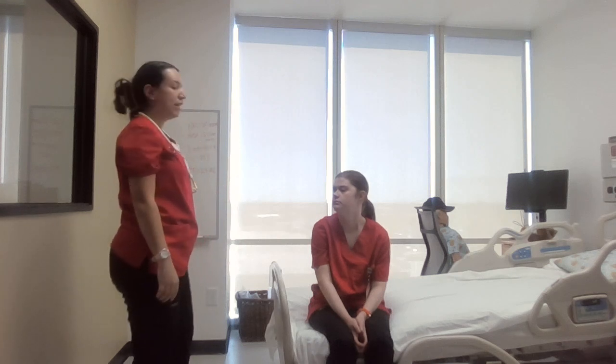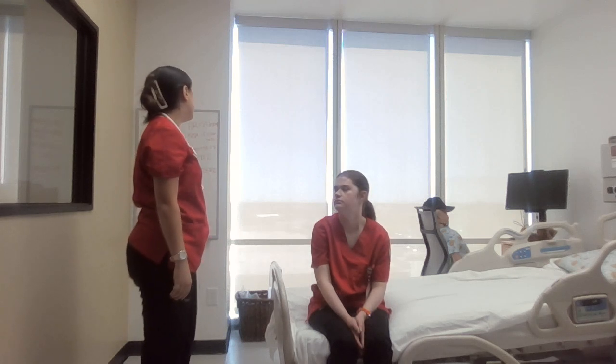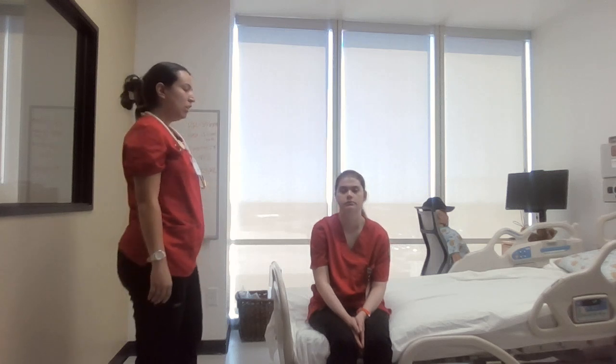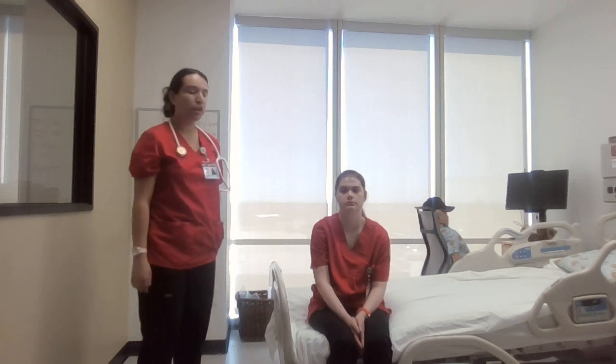For the heart rate, which was 80 beats per minute, +2 on the left radial pulse, regular rhythm, and then the blood pressure was 124/82 on the right arm. Next thing I'll do is ask them a few questions about their cardiac history. So, do you have any history of cardiac disease?